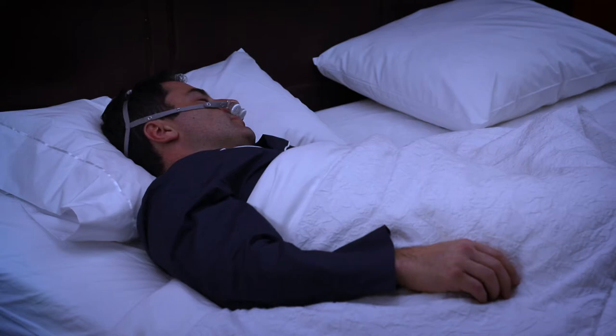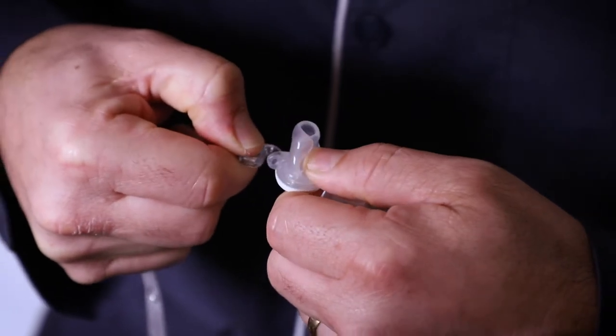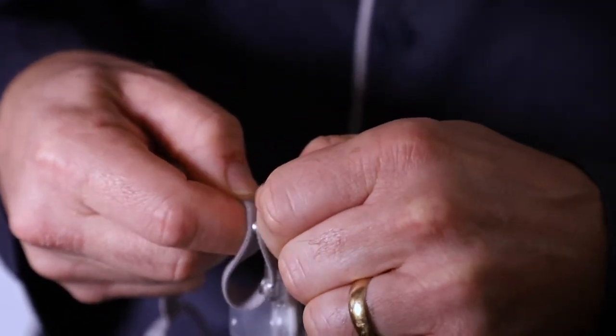An optional headgear accessory comes with your Bongo RX if you prefer. Attach the headgear to the device using the quick connect buckles. The length of the headgear straps may be adjusted for your comfort.